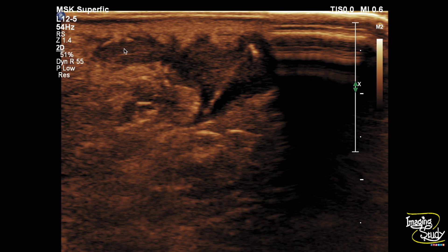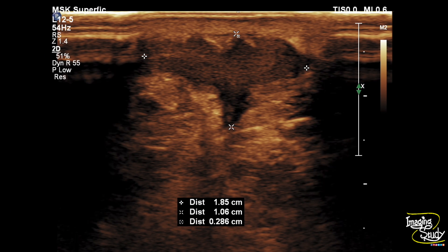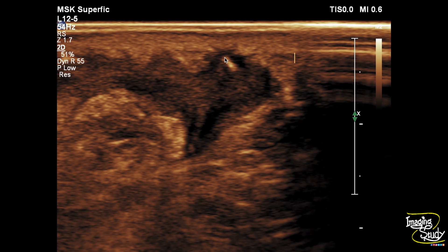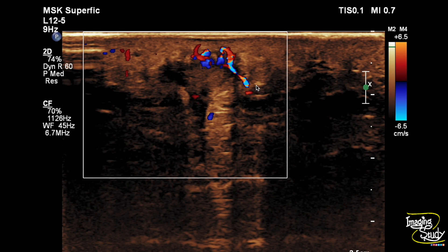You can see this echogenic structure within the irregular thick-walled abscess cavity containing some debris. The skin appears slightly thickened and the surrounding fat plane appears irregular. The length of the fish bone is around 10 millimeters. The abscess cavity is seen around three millimeters deep to the skin. The color Doppler picture shows peripheral vascularity with very prominent vessels, as the bone was impacted here for around three months — so definite changes have occurred.